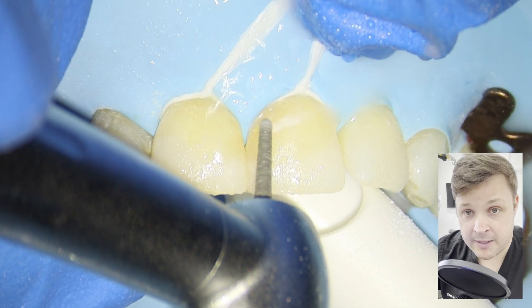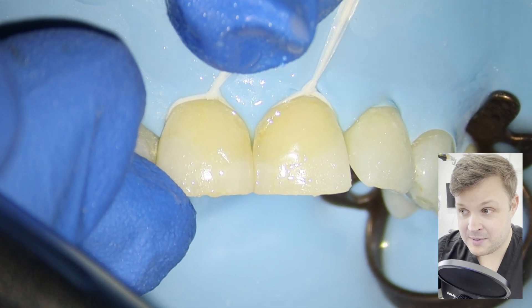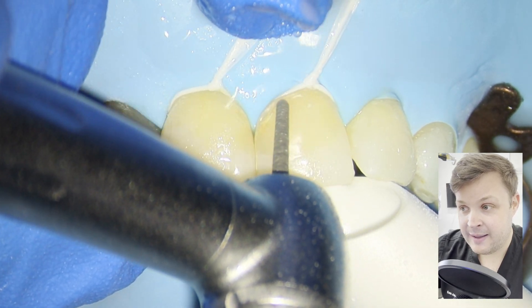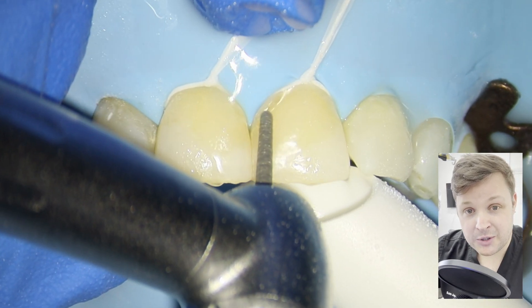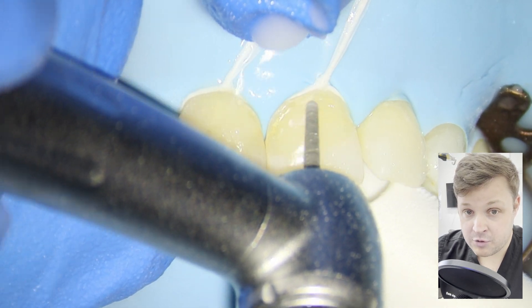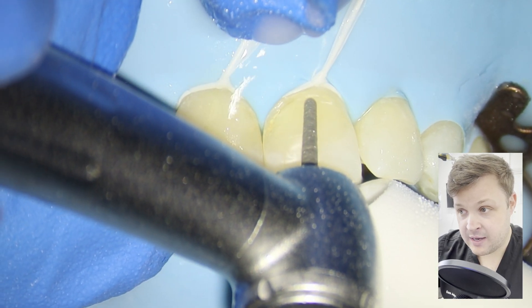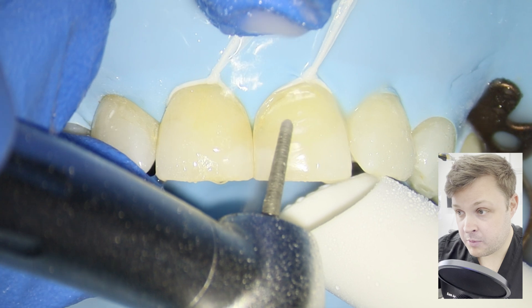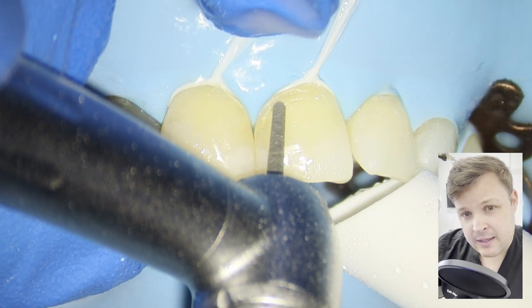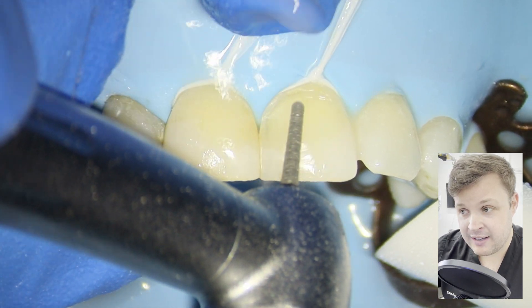I've tied both floss ties to the rubber dam frame. When I did the first floss tie it was nice and tight, but when I did the second one it made the first a little bit loose. So you'll notice that while I'm drilling and placing the filling, I'm just tightening that floss tie with my hands to retract the gum away.